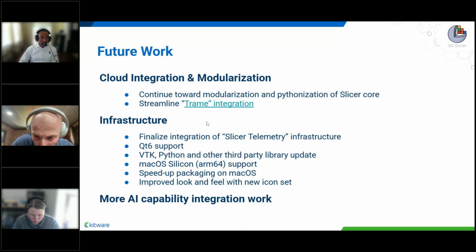Obviously, with a continued interest in AI in the medical image analysis community, we're actively working on deeper AI integration with 3D Slicer. So this spans a lot of different areas. One area is having better built-in model management, so you can have different AI models that you can query and use within 3D Slicer.